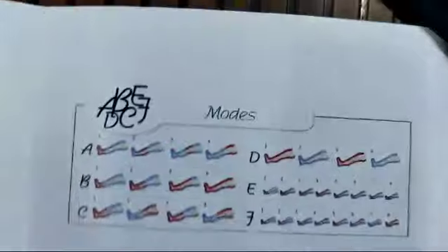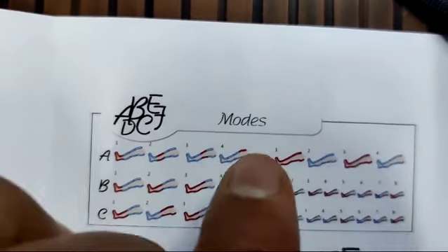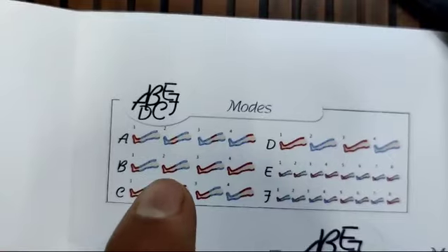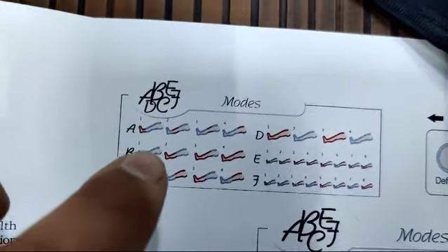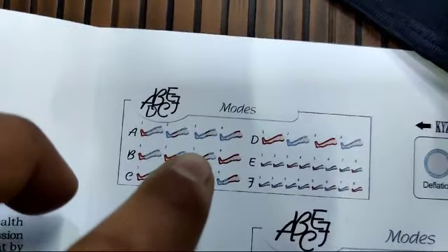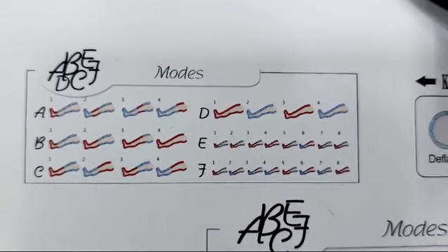This is the manual. The six modes A through F are described here. In Mode A, the first chamber inflates, then the second, third, and fourth sequentially. In Mode B, first chamber inflates, then first and second together, then first, second, and third, then all four — as you saw earlier. Other models on the market have only three modes A, B, C, whereas this device has six modes.